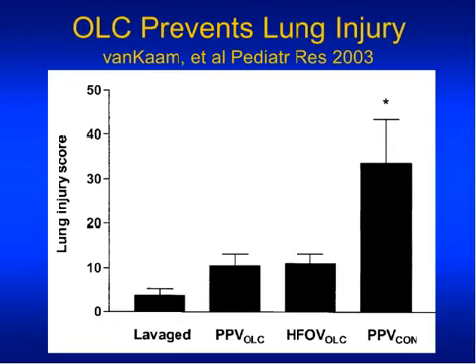In red is the dead space. At the end of exhalation, exhaled gas rich in CO2 sits there. When you breathe in a 5 ml tidal volume, only 2 ml of fresh gas moves in, supposedly. If you reduce tidal volume from 5 to 4, you still have 3 ml dead space, so you would only get 1 ml of fresh gas in, and when you reduce tidal volume to 3 to equal dead space, you would have no fresh gas entering the lungs.